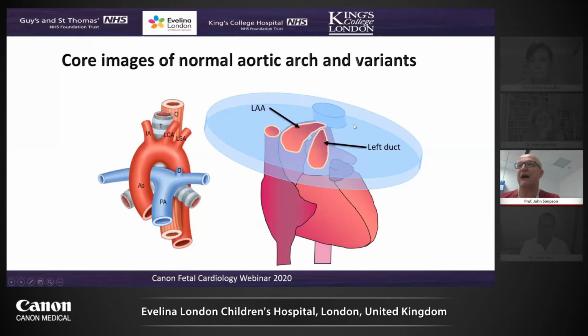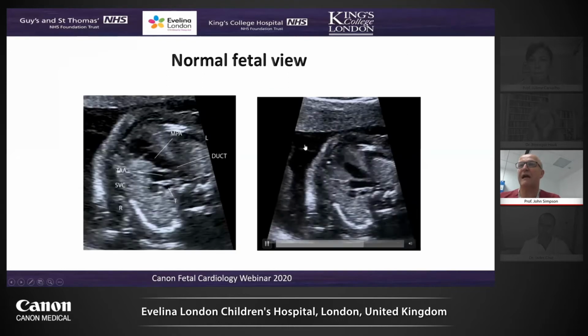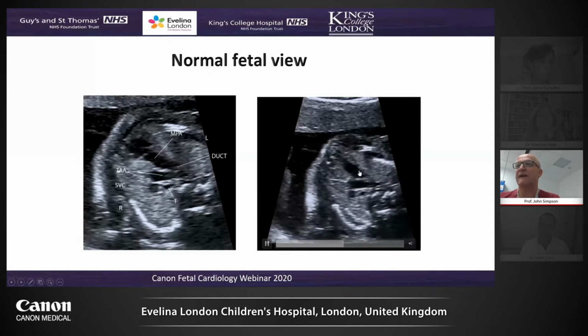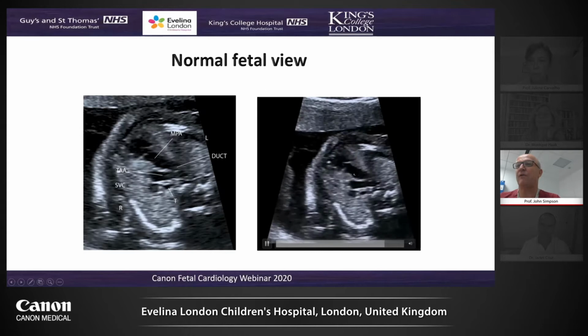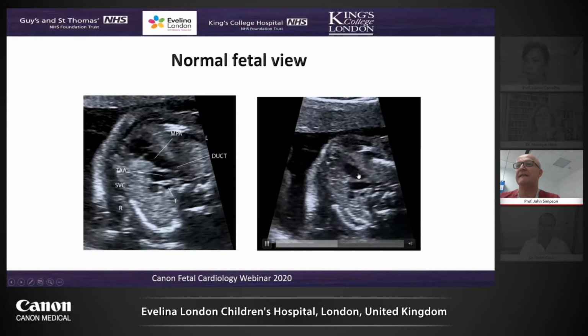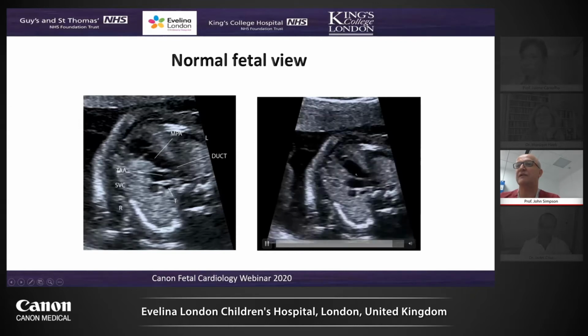And if we look at the sonographic equivalents of those, we actually mainly, I guess, do this by eye. We're now seeing the right ventricle, pulmonary valve, and duct. We now see the transverse aortic arch, and these vessels come together in a normal V, with the trachea here outside of this V formed between those vessels. And just to emphasize what Monique said again, in descending order of size, you can see from the duct, transverse aortic arch, to the superior vena cava.